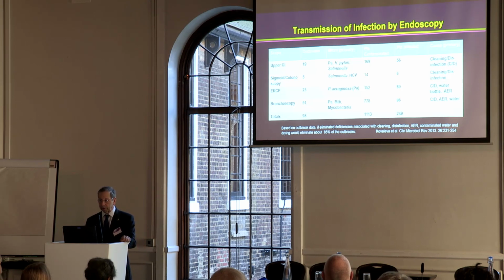And as you can see, these have led to patients becoming colonized a number of times and patients being infected a number of times. So again, most of these transmissions in the past, up until recently, we felt were due to inadequate cleaning and inadequate disinfection. Now, this cleaning and disinfection is enormously difficult.